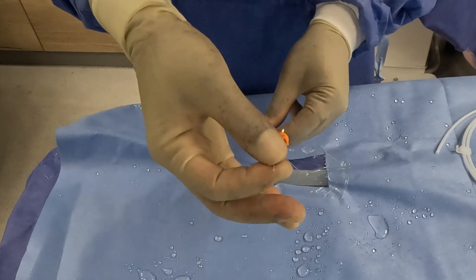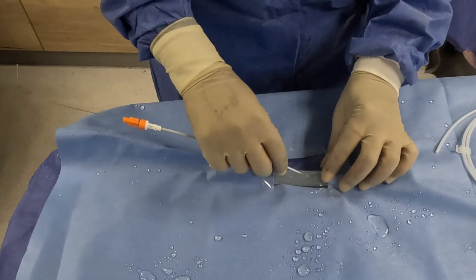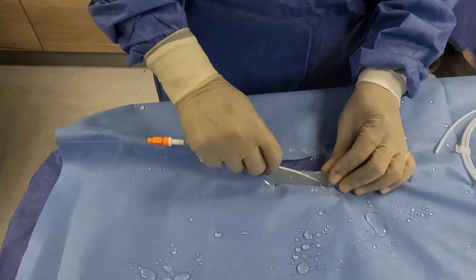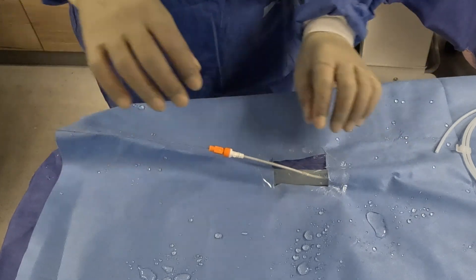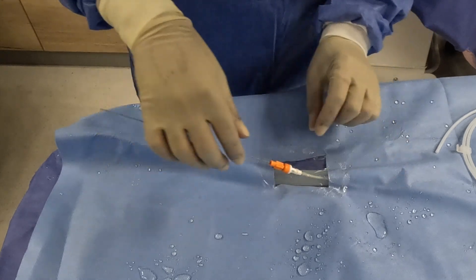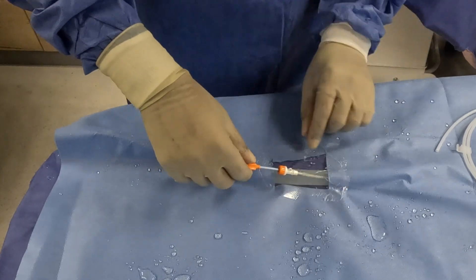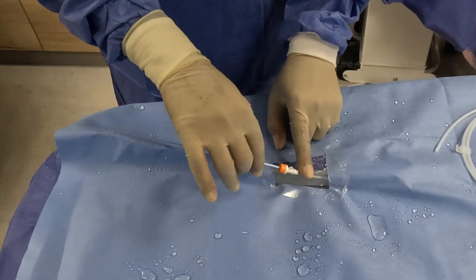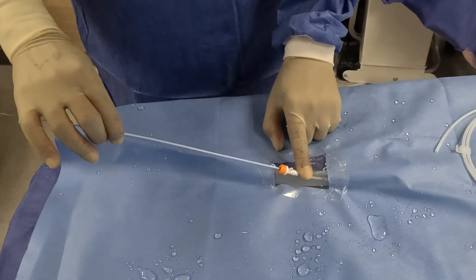Advance the sheath introducer over the guide wire and into the artery using a rotatory motion. Withdraw the introducer dilator with the guide wire, leaving the sheath in place.